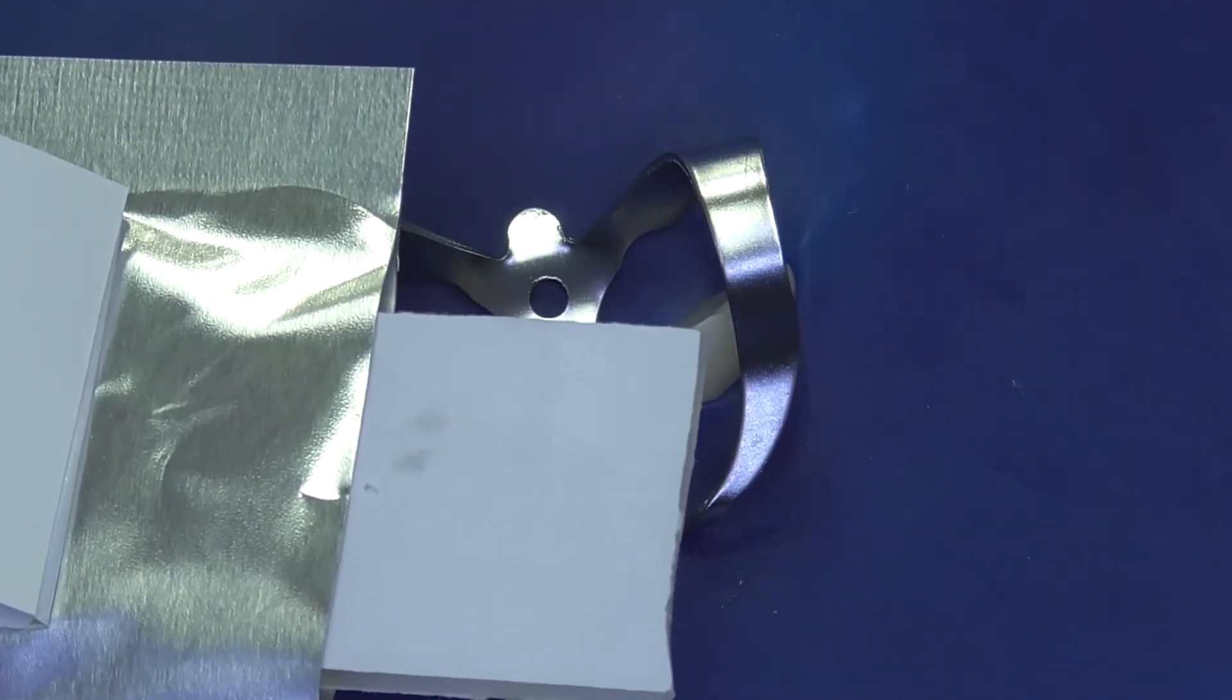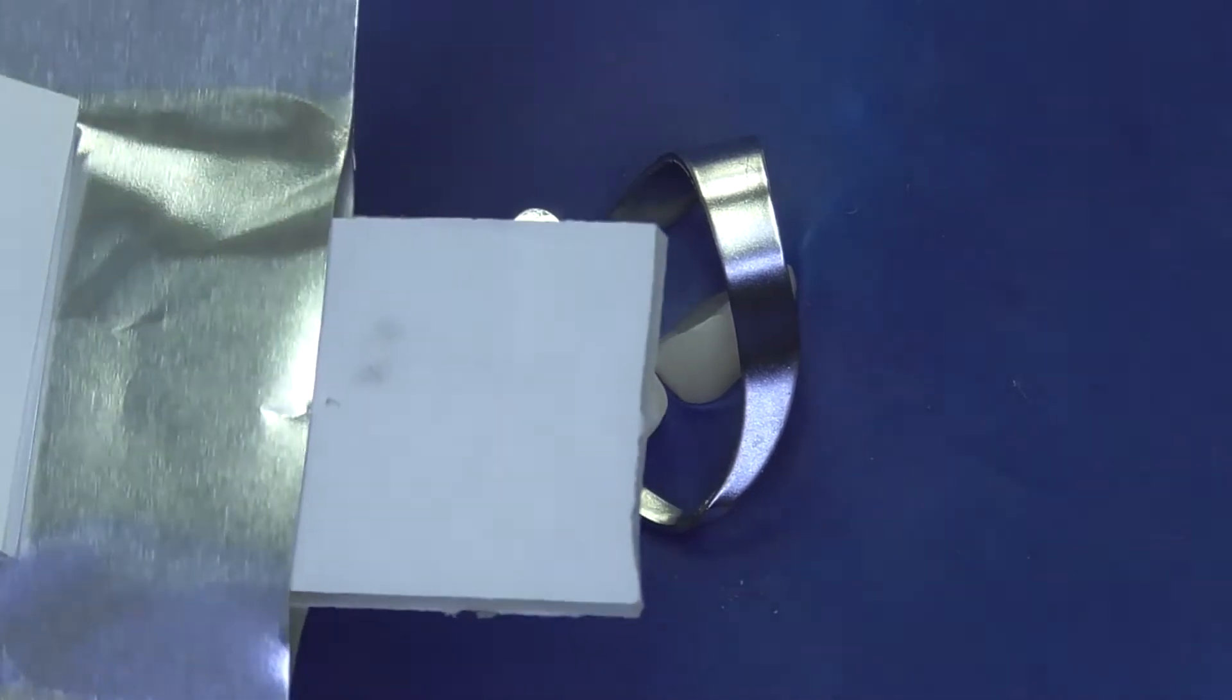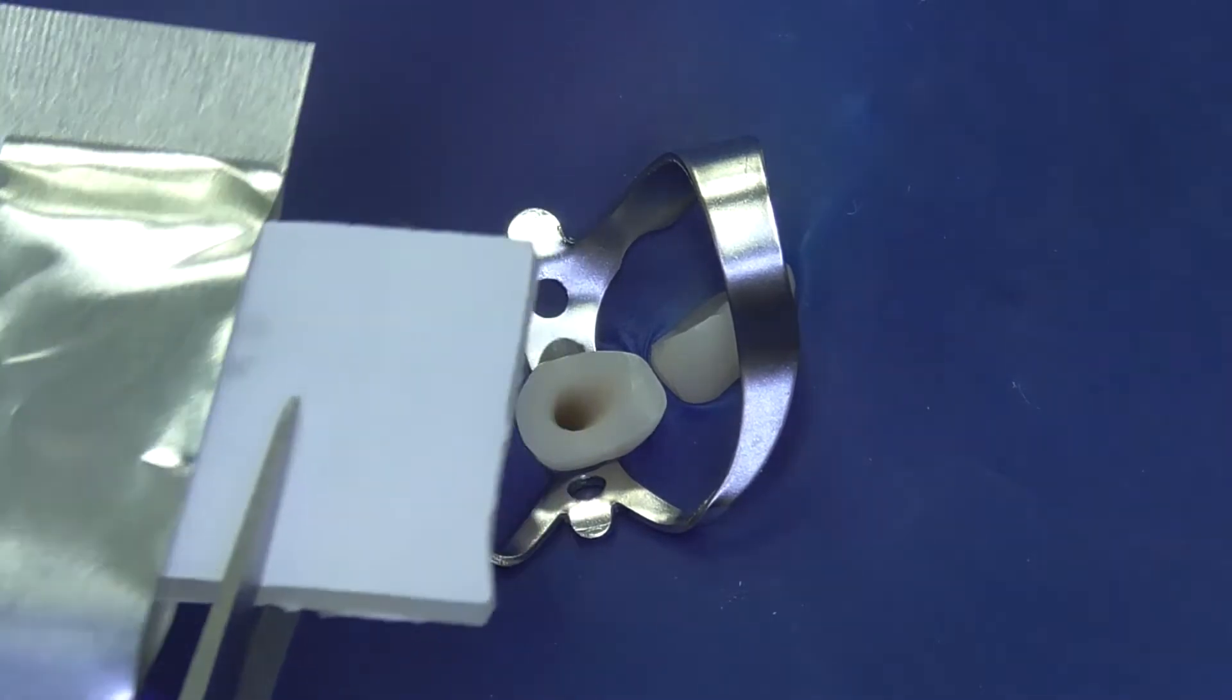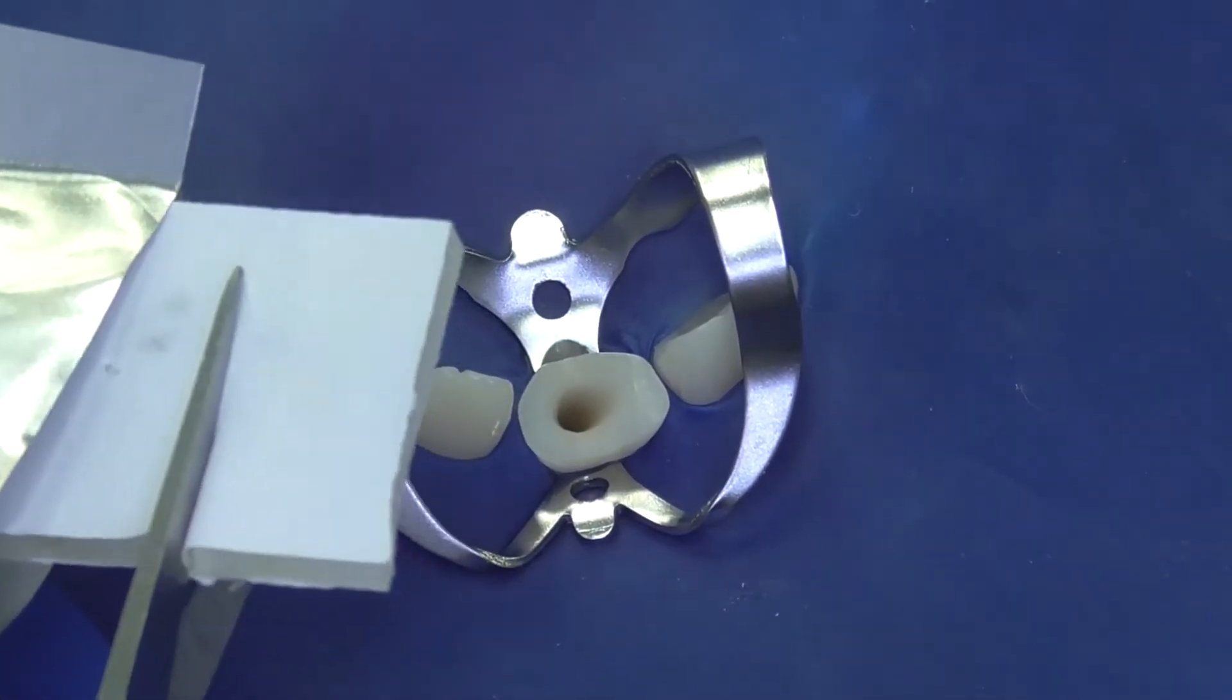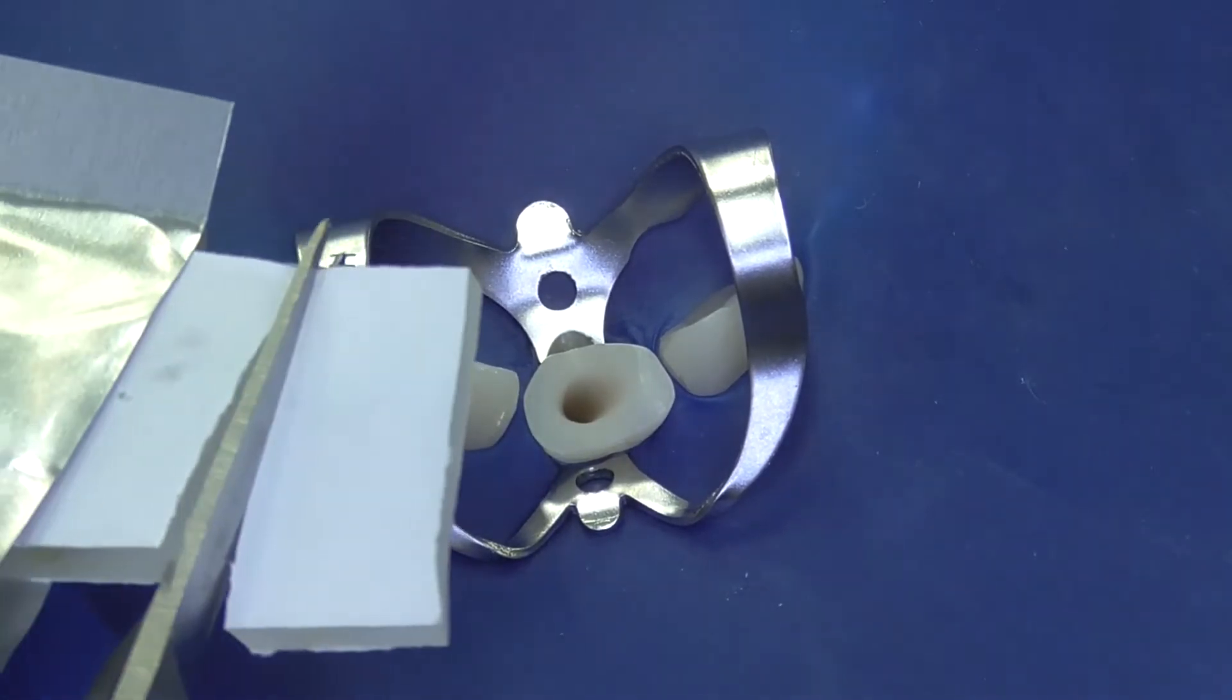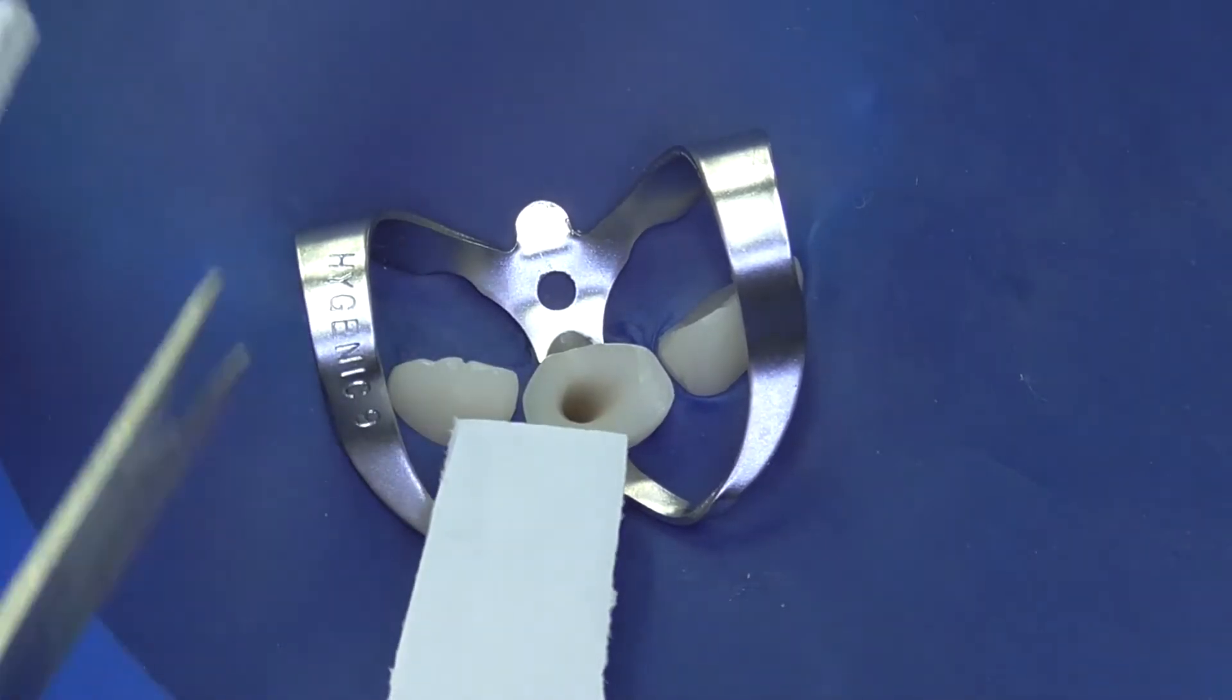We are cutting the post in its silicone package with scissors, and we will reshape this post material to have the best possible fit to the root canal.